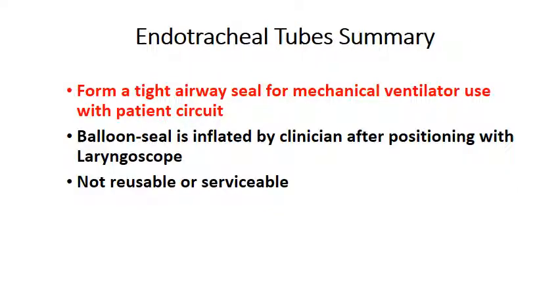Pretty simple summary for endotracheal tubes. They form a tight airway seal for mechanical ventilator use with a patient circuit. The balloon seal is inflated by the clinician after insertion, and they're not reusable or serviceable.